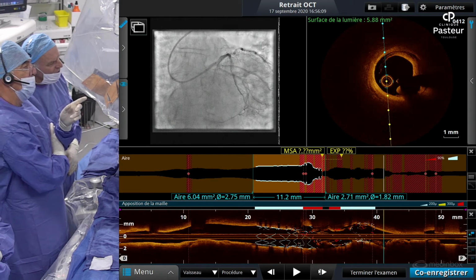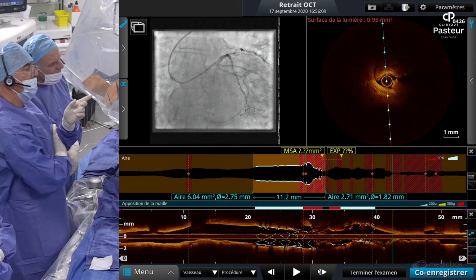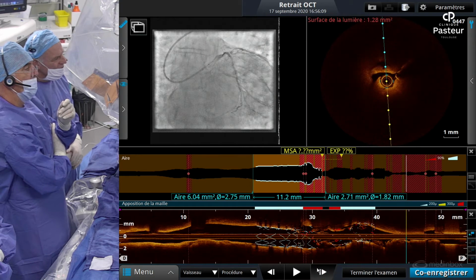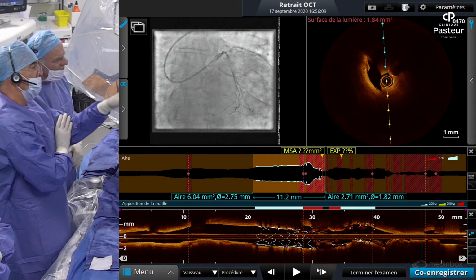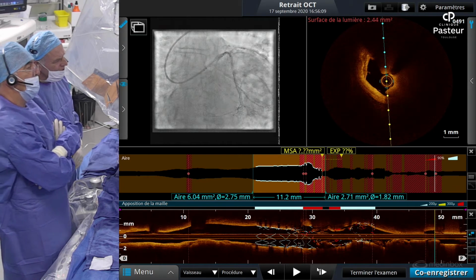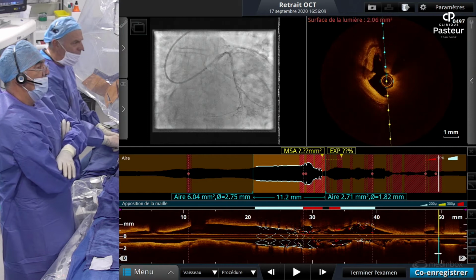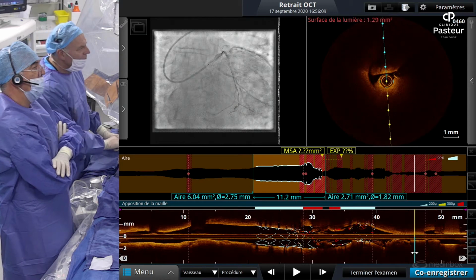Here we are. That was a stent, no? Here, look at that. Very severe. Continue, and we will arrive inside the guiding. So that's the left main, and it was the stent. The stent is well opposed in proximal with a 3.5 balloon. But look at this image here in the tube. So now move distally. Slowly. Look at the left main here. Good. Wow.